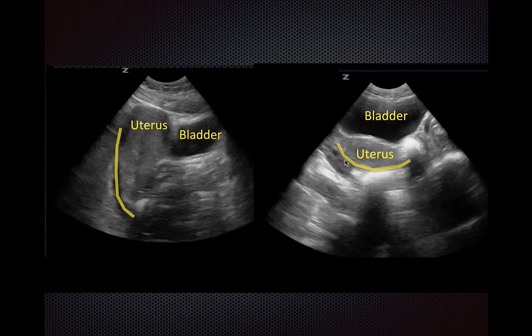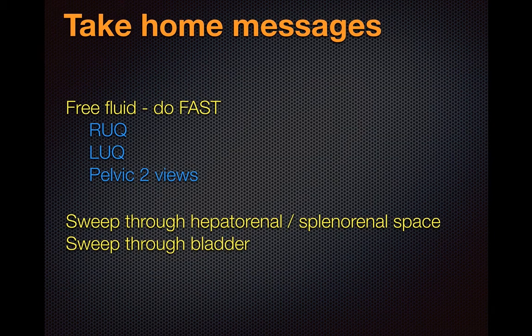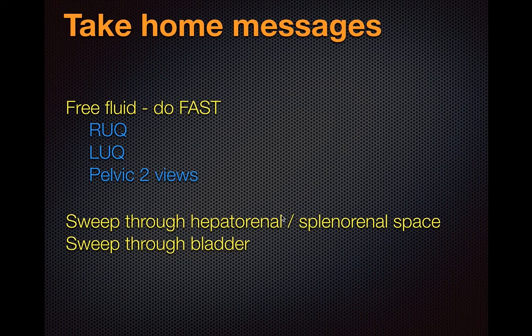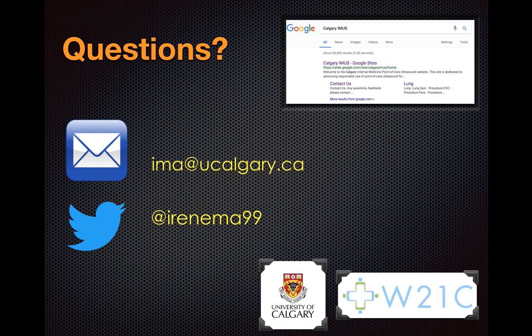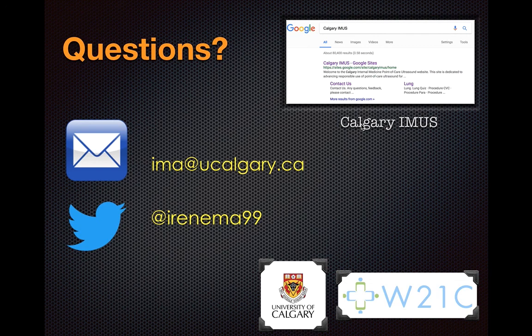The take-home messages: we've covered the technique for identifying intra-abdominal free fluid using the FAST approach — right upper quadrant, left upper quadrant, and two views in the pelvis. In the upper quadrant views, make sure you sweep through the hepatorenal and splenorenal spaces respectively. In the pelvic view, sweep through the entire bladder. Thanks for tuning in — feel free to ask questions. Our videos are uploaded on the Calgary IMUS (Internal Medicine Ultrasound) website, where you can find additional tutorials.